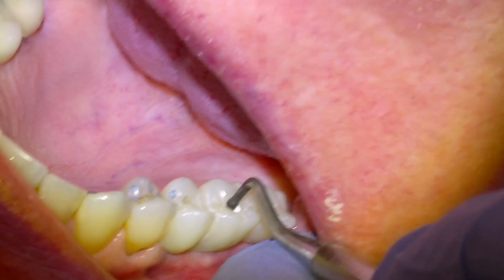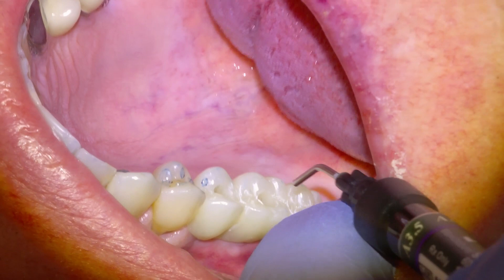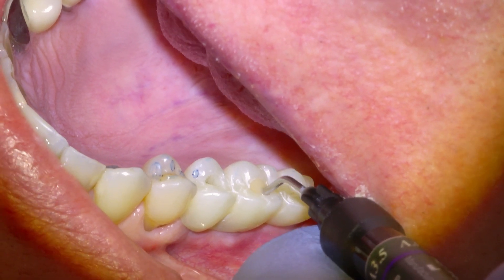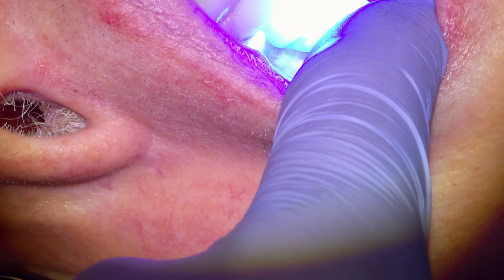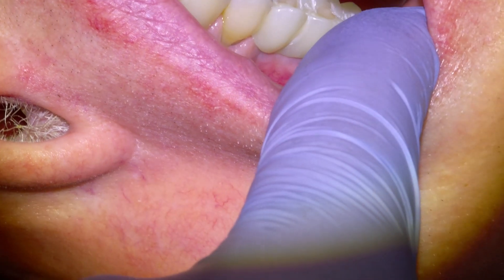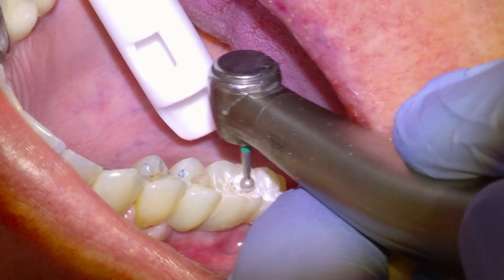We'll pack down our second screw channel with teflon tape, and then the rest of the way we cover it up using a standard dental filling material. This is called flowable composite, which can be used in a standard filling in certain situations. We'll cover up the screw hole, usually overfill it a little bit, and then light cure the material — that hardens it from a flowable paste into a solid. Then we'll trim down the overfilled screw channels so that it's flush with the rest of the bridge with no high spots.